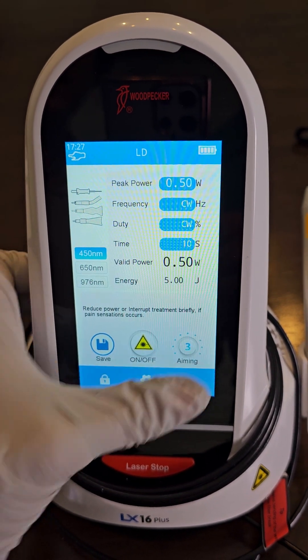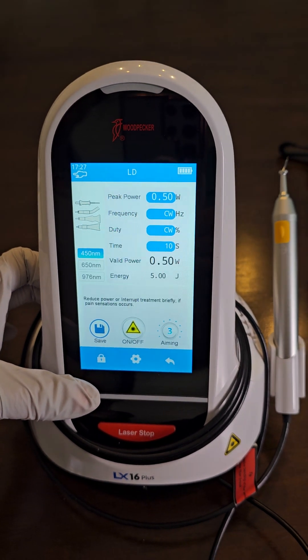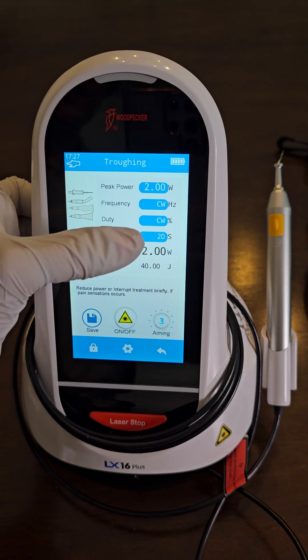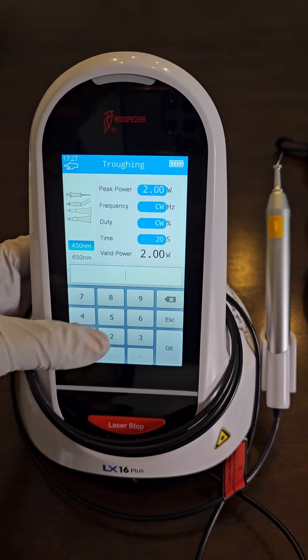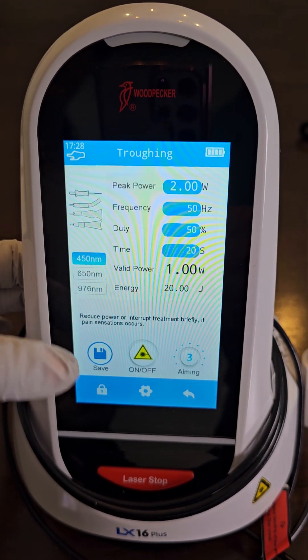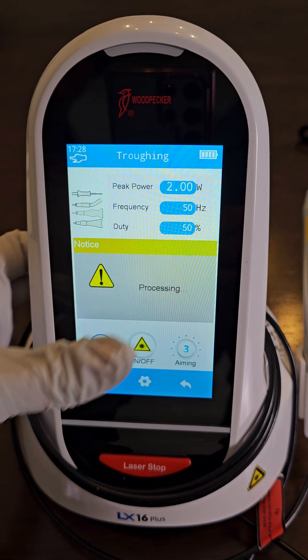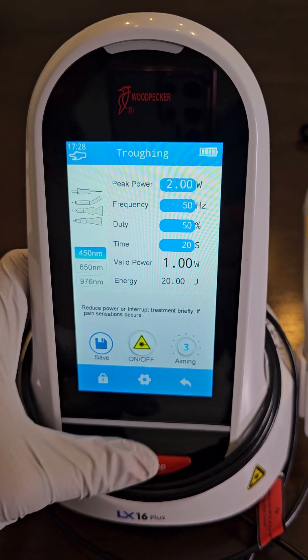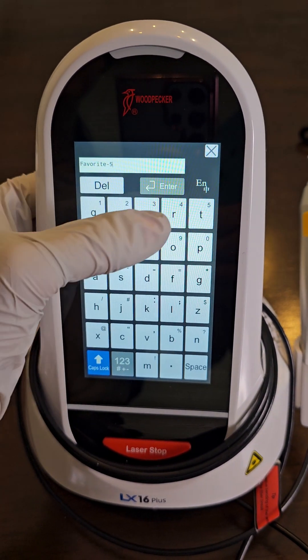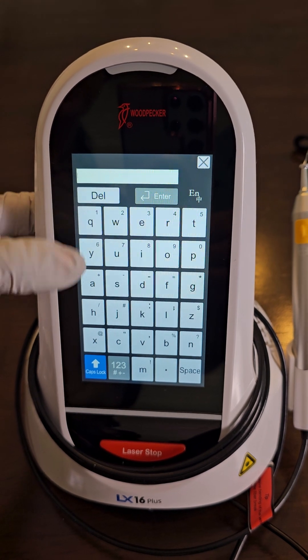Let's set it for 10 seconds so we don't treat a pocket longer than that. Aiming beam is on high — save. Now for doctor procedures, I program troughing. We have 2 watts, frequency at 50 Hertz, 50% duty cycle, average power of 1. We're on the 450 wavelength, aiming beam is high. Save this.